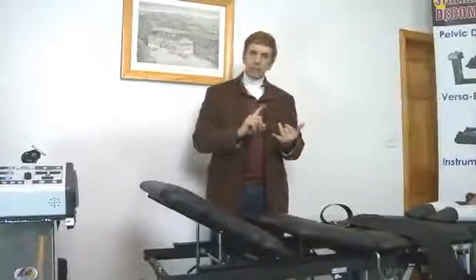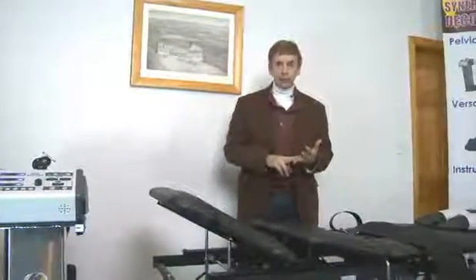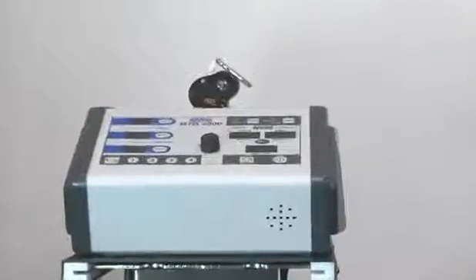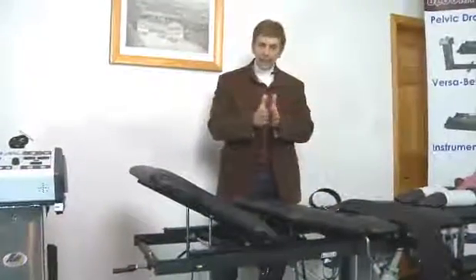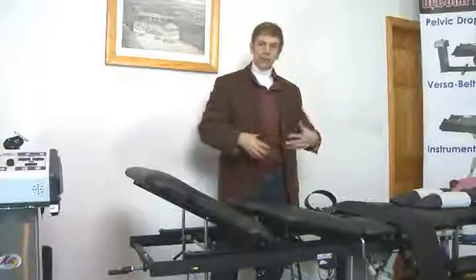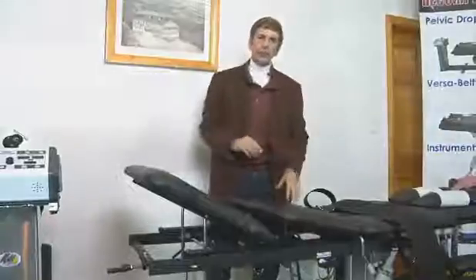Now we want to stay away from being dogmatic about the pulls, how much force we're using, the high force, or dogmatic about too little force. As long as we have sufficient force to allow the patient to perceive the belt tightening on their waistline and a movement of the table. Again, the table can move up to 5 inches. We don't want the table separating dramatically each pull. We want it to be controlled and the patient's perception of the tension on their waistline to be in configuration with the table moving towards the motor.